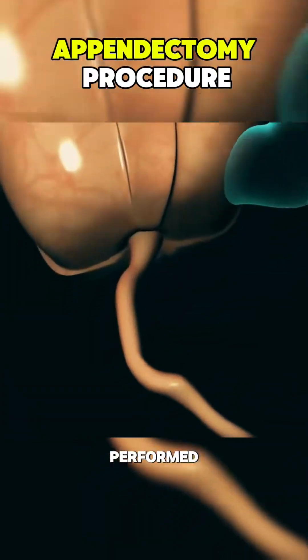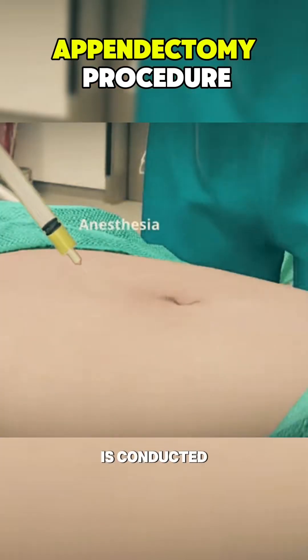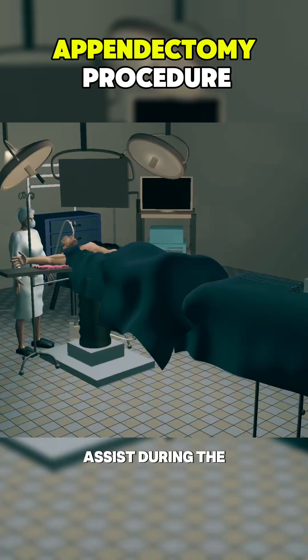Ever wondered how an appendectomy is performed? Here's how it works. First, an intravenous line is established, and the procedure is conducted under general anesthesia. A breathing tube and sometimes a catheter are inserted to assist during the surgery.